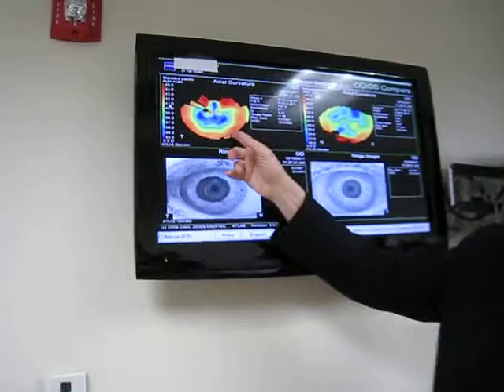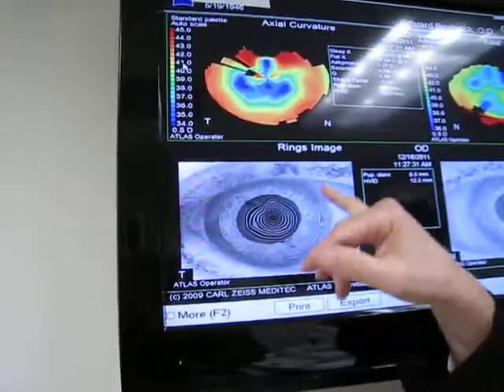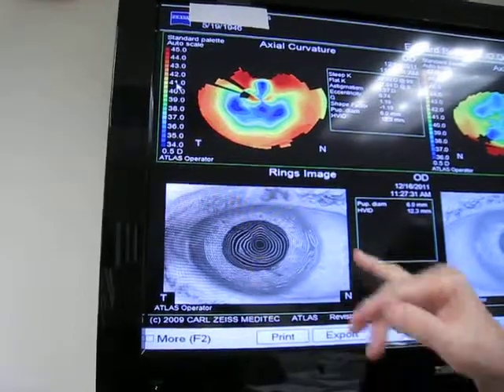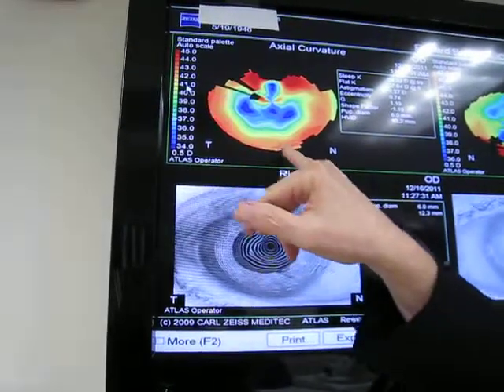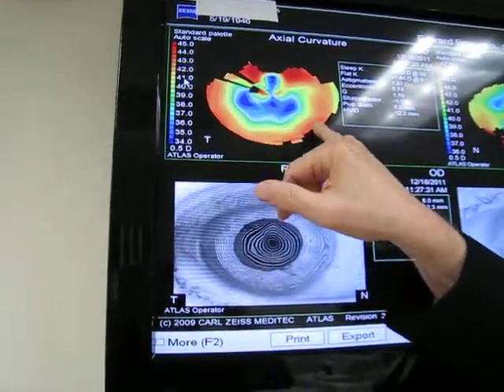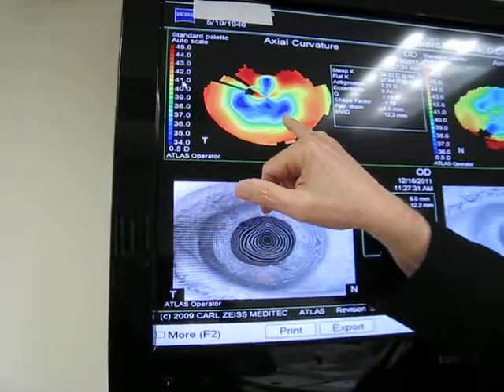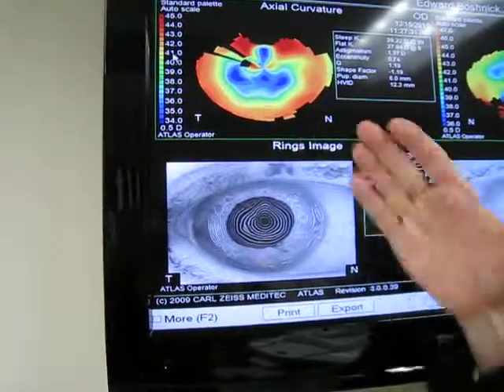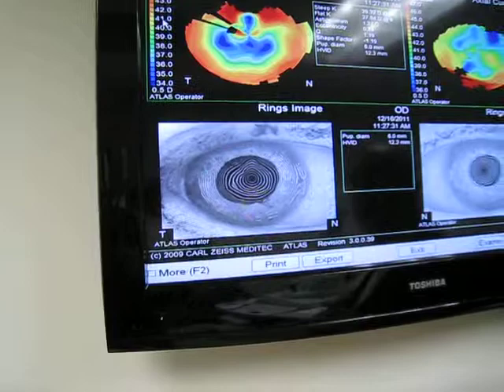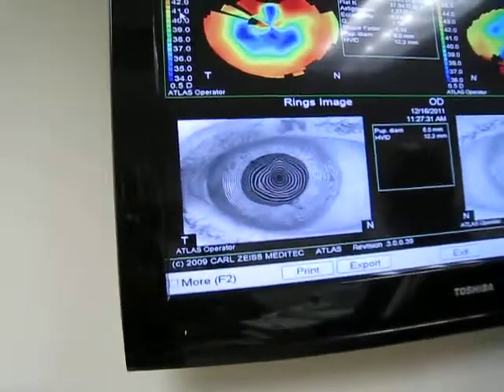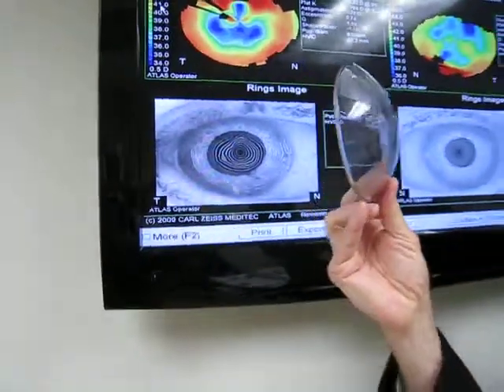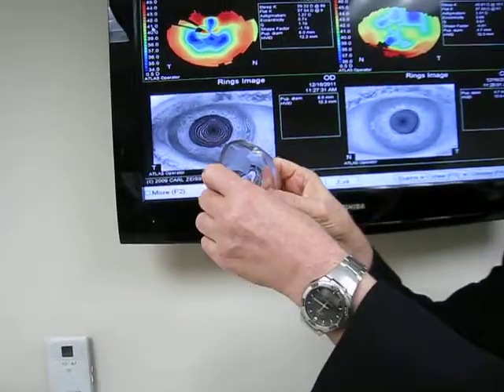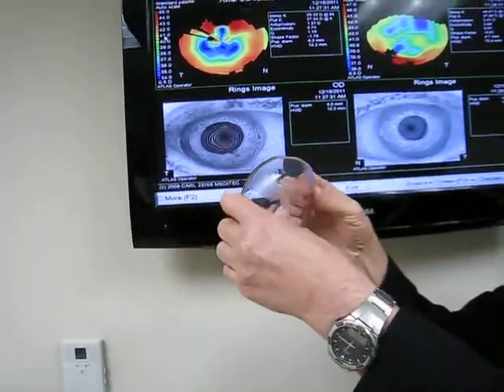This particular patient underwent RK surgery as well as LASIK surgery. Where you see the blue are depressed areas of the cornea — the darker blue means the further the depression. Where you see red is where you have an outpuckering of the cornea. So this particular cornea, instead of being nice and smooth, would be highly distorted.